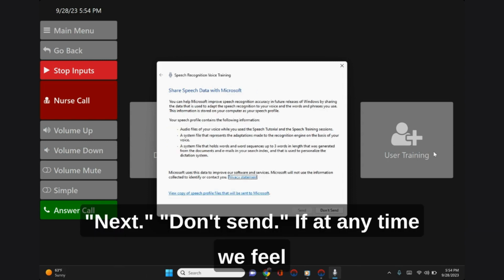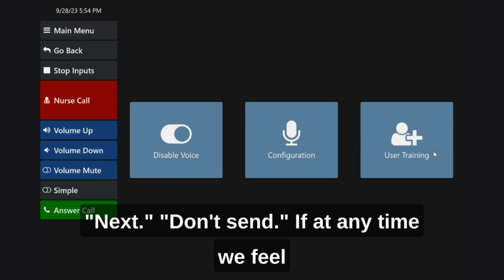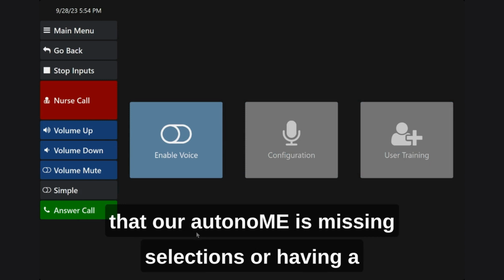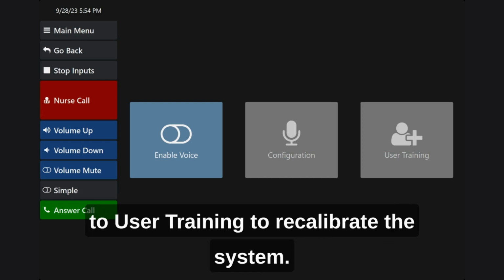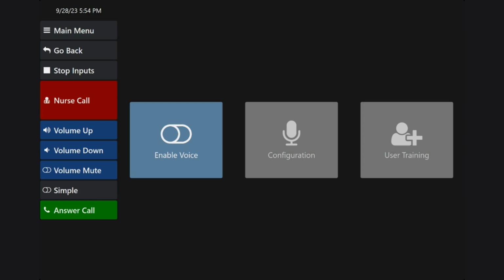Next, don't send. If at any time we feel that our autonoME is missing selections or having a difficult time hearing us, we can always go back to user training to recalibrate the system.